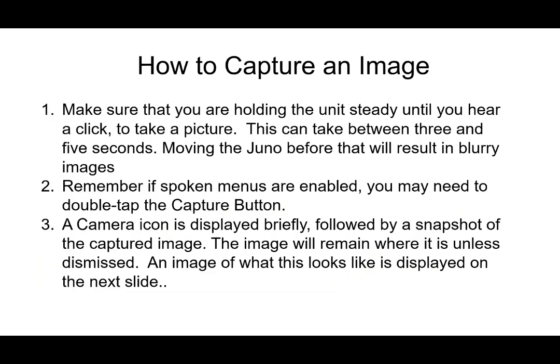So how do you capture an image? Well, firstly, you're going to position the Juno over the item or image or document that you want to capture. And you're going to hold it steady over it and tap that capture button. And remember, if the spoken menus are enabled, you're going to need to tap that capture button twice. If they're not, once is sufficient. But once you've tapped that capture button, you're going to hear a click. This can take between 3 and 5 seconds.